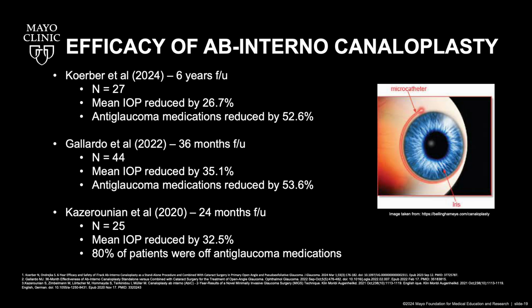Other studies, including those at 3 years and 2 years, indicate similar results, with intraocular pressure reductions greater than 30% and similar reductions in anti-glaucoma medications. So these outcomes highlight the procedure's long-term efficacy and safety, and it supports its role as a viable option for glaucoma management.